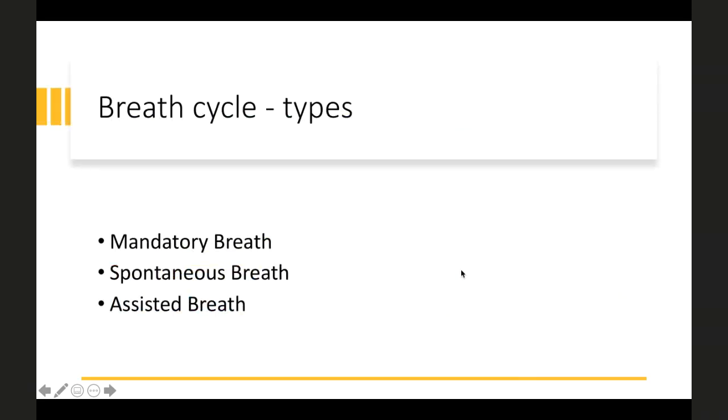Now, speaking about the breath cycle, we are coming to full-fledged mechanical ventilation. We are going to push in breaths and monitor the breaths. You need to be familiar with three terminologies for sure: mandatory breath, spontaneous breath, and assisted breath.